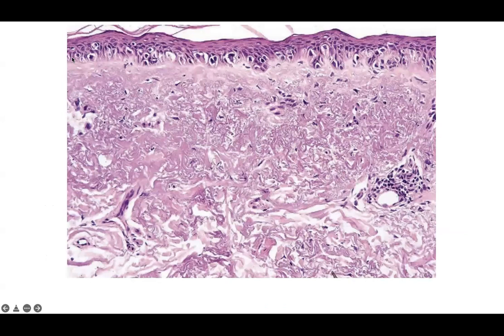Here we have a contiguous growth of atypical melanocytes along the dermal epidermal junction. You can see the nuclear pleomorphism among the melanocytes. The melanocytes stick out because they have this prominent halo artifact with this strandy material around the nucleus, and no surrounding desmosomes. However, nowadays, I usually like to sign out my reports with at least a SOX to confirm the extent of contiguous growth or pagetoid upward migration, especially on the head and neck of patients with severely sun-damaged skin, if it is a subtle or borderline case.